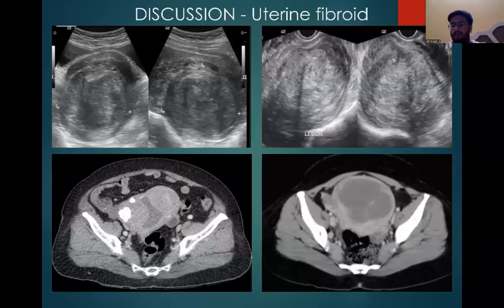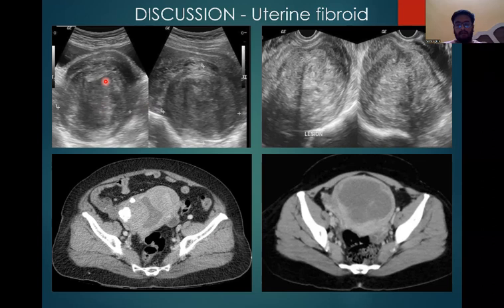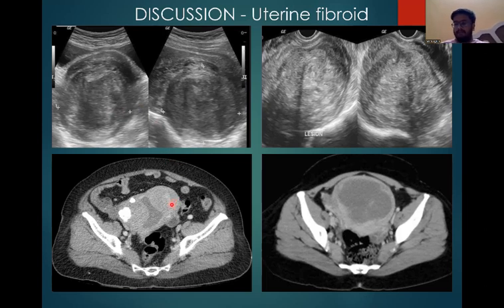Discussion — uterine fibroid. Uterine fibroid on transverse ultrasonography shows a hypoechoic mass in the posterior myometrium causing distortion of normal uterine contour. On CT scan, we are able to see the mass appearing as soft tissue density with peripheral density changes, distorting the normal contour of the uterus.